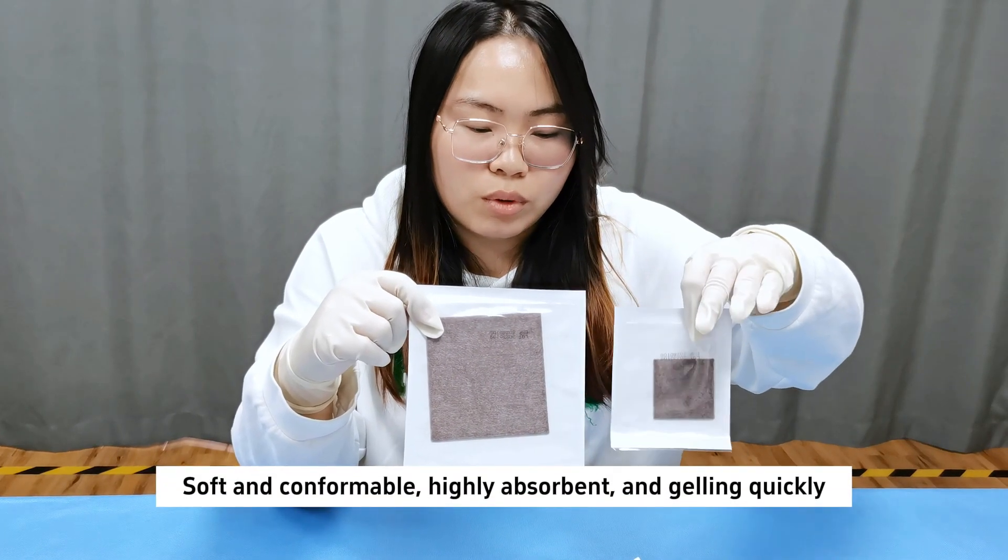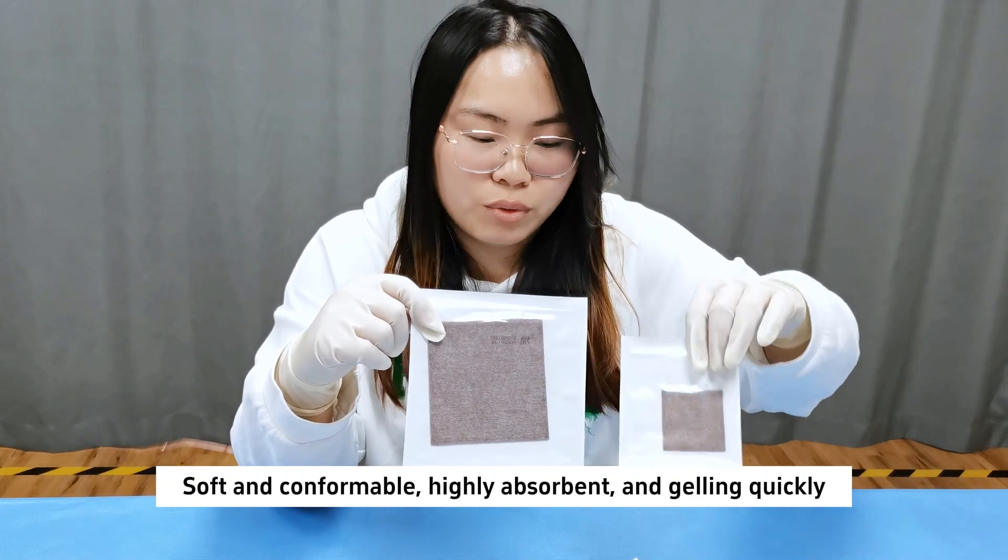Soft and conformable, highly absorbent, and gelling quickly.